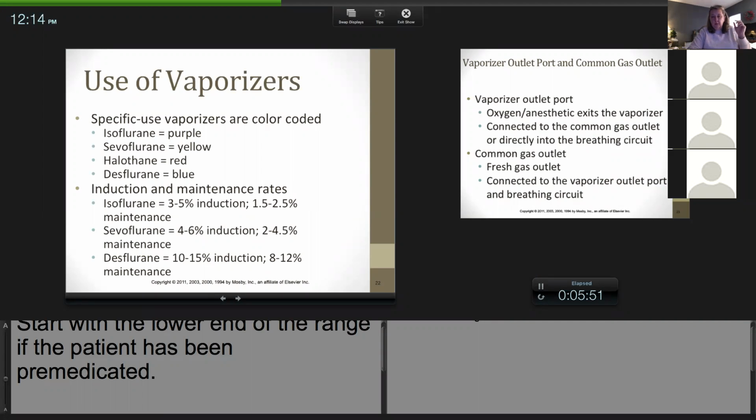When you intubate, you turn on the oxygen, start the inhalant, maybe two, then you get your heart rate, respiration, check your jaw tone, eye position, your reflexes, and then always try to turn them down, run the lowest amount. Now, it's not on this slide, but if you remember MAC, MAC is minimum alveolar concentration, and every inhalant has a MAC value, like isoflurane in the dog is 1.2%, meaning that if 50% of dogs will not react to a painful stimulus if they are at 1.2%.